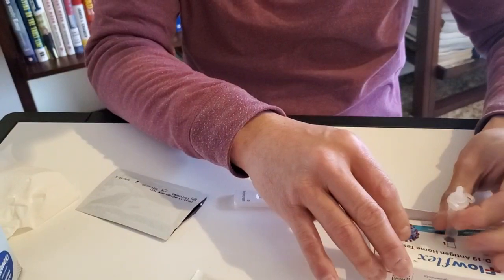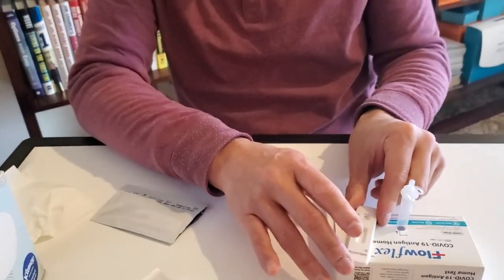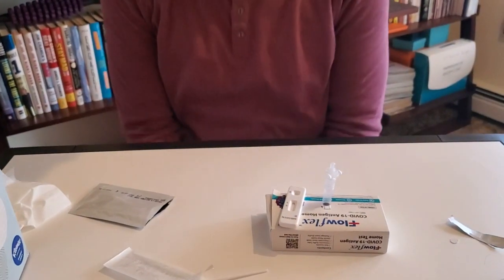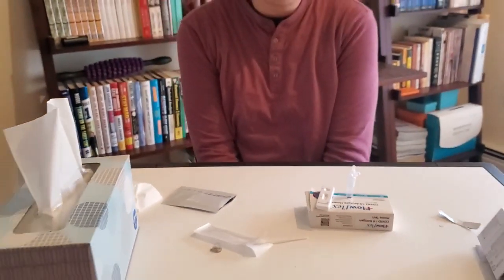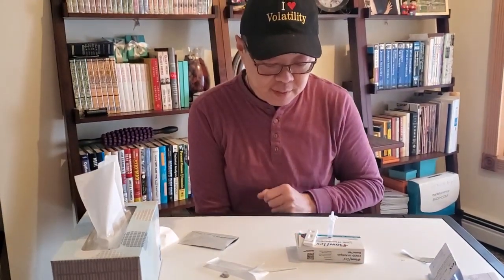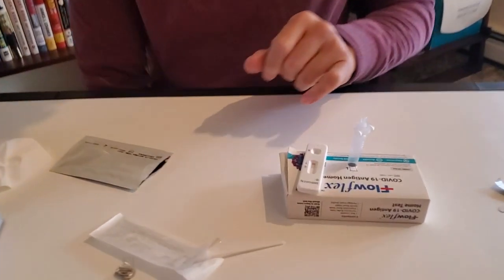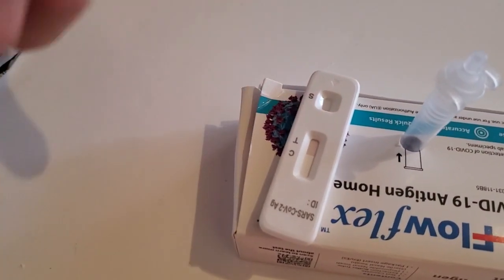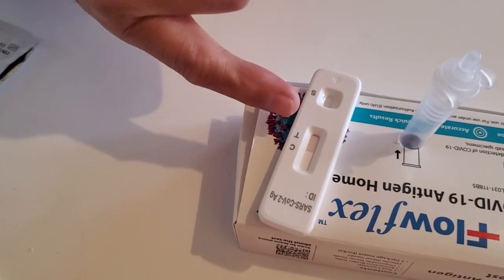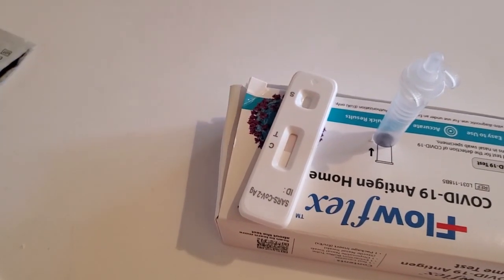You're supposed to read the result within 15 to 30 minutes. Do not read the result past 30 minutes. You'll see it's turning color and you'll see lines appear — it's almost like a pregnancy test. If there are two lines, whether faint or solid, you're positive. If there's one line, it's negative.